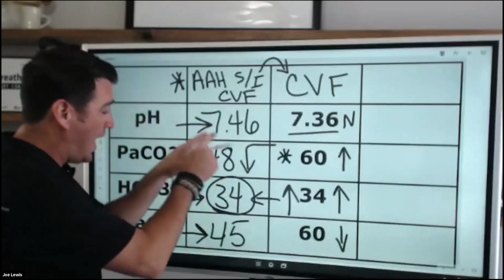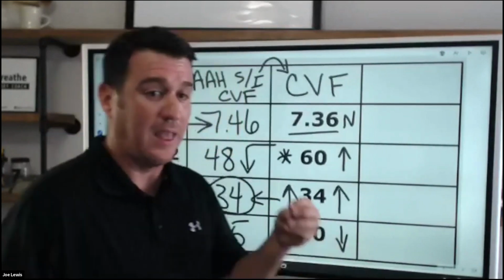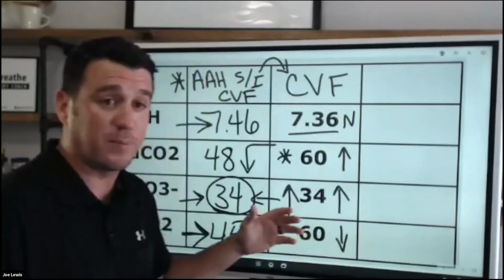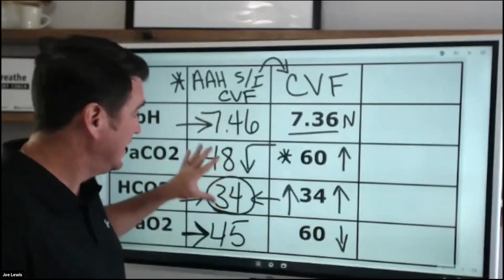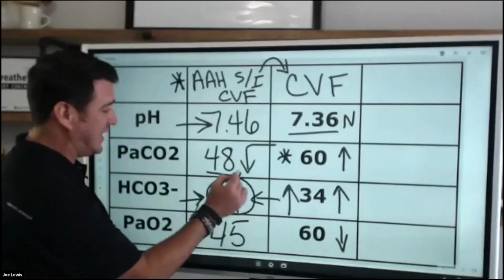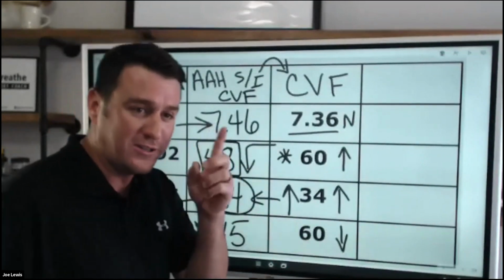You have to recognize, why is this person hyperventilating? Because of the hypoxemia. Now, it could also be that they're just early into the process of an acute exacerbation. So that's 100% true. It could 1000% be that. This is maybe an impending exacerbation that's coming. But as we see right now, even though this looks elevated, that's where it gets tricky. You look at this, you go, oh, elevated CO2, that's weird.